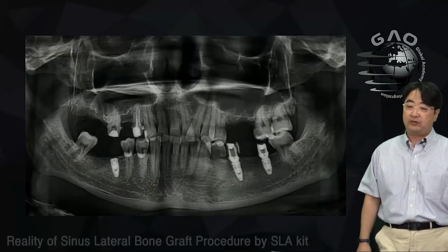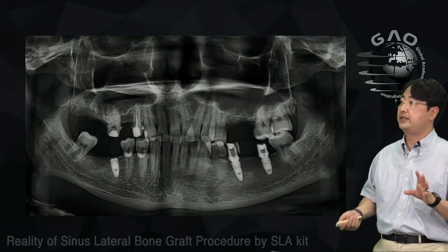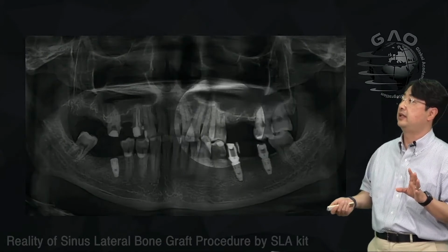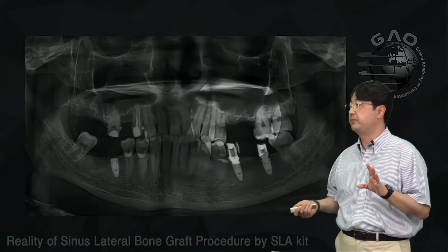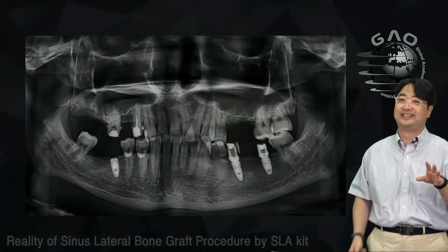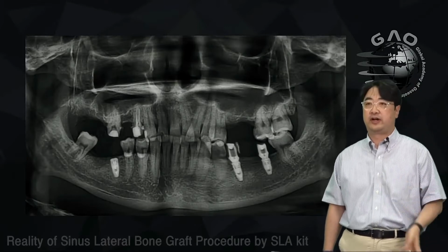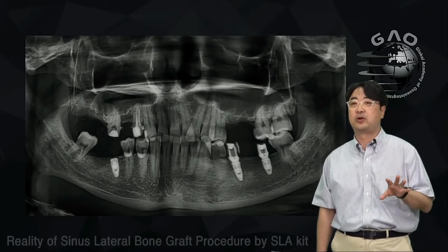From now on, I'm going to show you a real clinical case of one of my patients. He needs a dental implant on the left posterior. And as you see here, there is not much bone for the implant placement. So definitely we're going to do some bone graft, a lateral sinus bone graft.